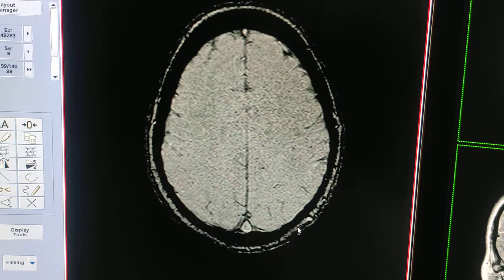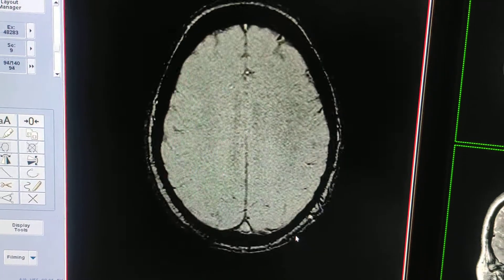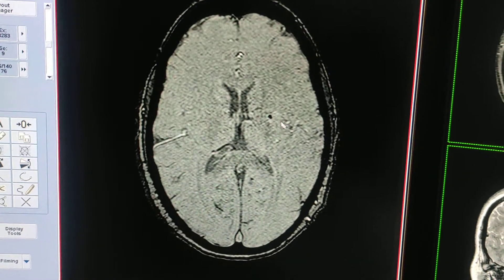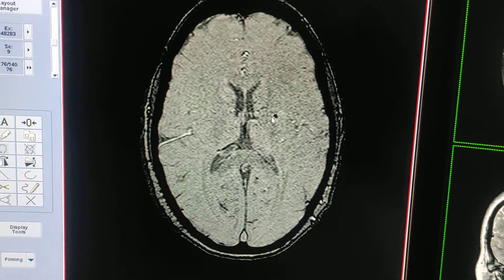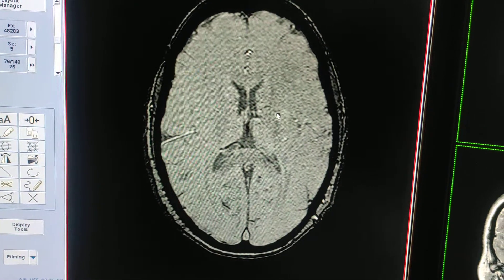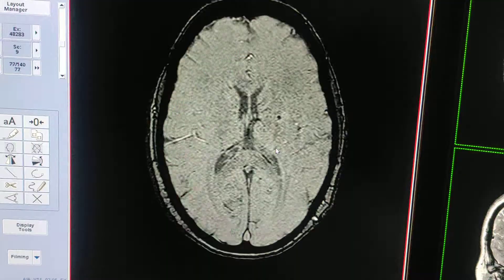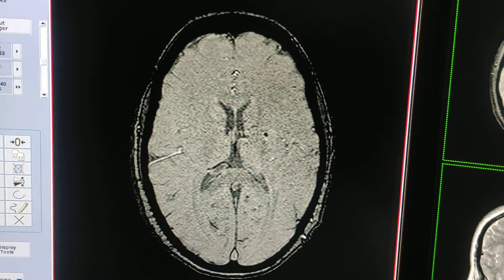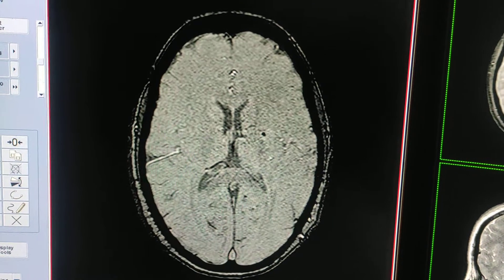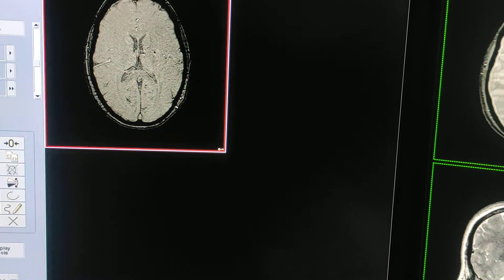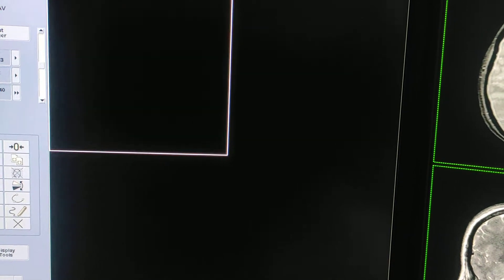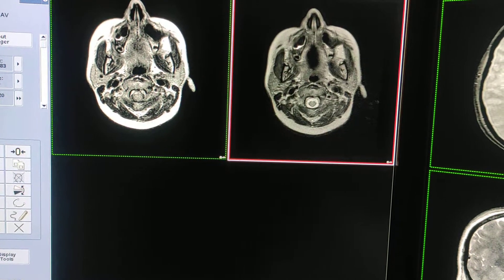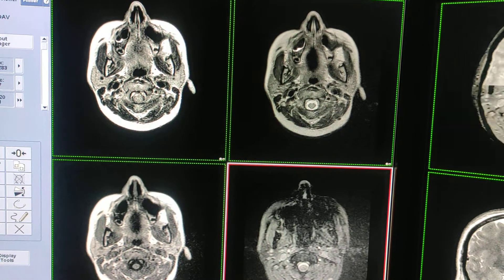Now I will show you a case I have done today, in which I have taken this SWAN sequence. Here you can see a black area — susceptibility — this is calcification. I will now show you the routine sequences: this is FLAIR, T2, T1, and the routine gradient sequence.